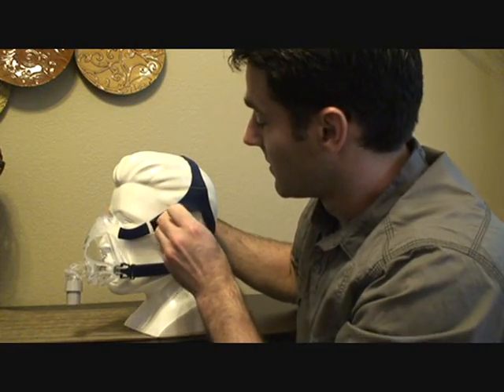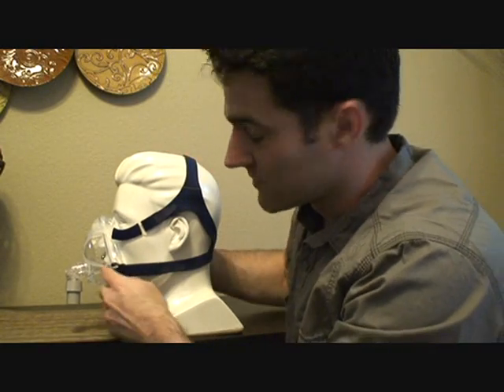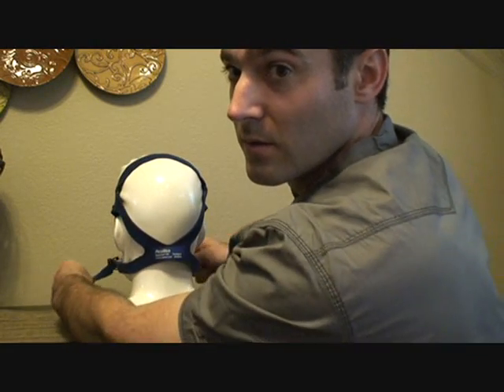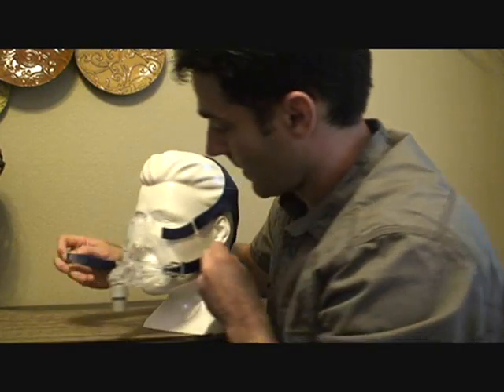The bottom part — if it's leaking down here, it's too tight. Undo these two straps, loosen it, tighten it. Once you find a comfortable area, try to keep the exact same tension and strap it down.